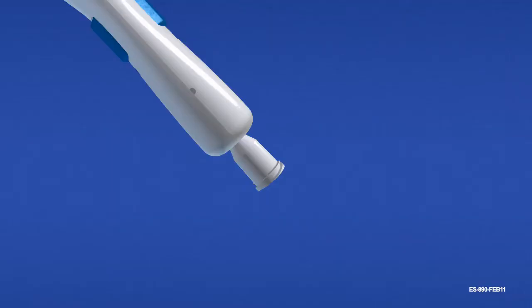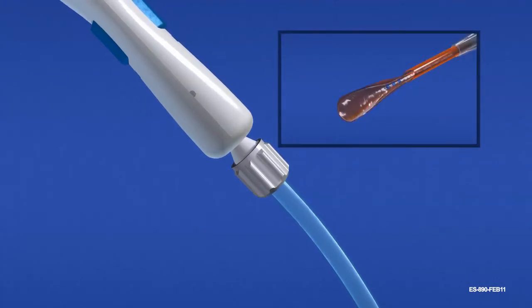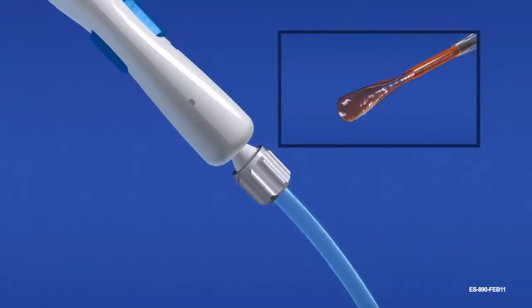The device must be flushed with balanced salt solution prior to loading. Connect irrigation tubing to the lure connection and flush with balanced salt solution. Remove excess moisture from the carrier with an absorbent sponge.